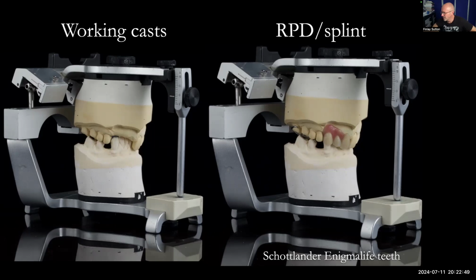Mustafa, thank you for an amazing case from a training perspective. Supposing you were going to use this for the ISFE exam, with your consultant's hat on, do you think placing milled crowns or onlays on the upper right 4, upper right 5, lower right 6, upper right 7, upper right 1, upper right 6, given these are heavily restored teeth, would be a reasonable approach? Additionally, do you use hard and soft tissue undercuts for retention?